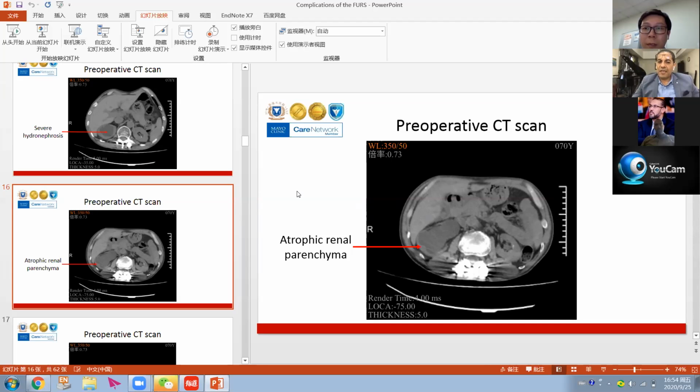So it's a very clear point, and Dr. Wang agreed that decompression in such cases is the ideal choice, whether through nephrostomy or double J stent. Then you can go for active stone management 2 weeks later, so the kidney can regain some of its power to avoid infection, and you can manipulate the stone much more easily and avoid complications that happened in such a case.